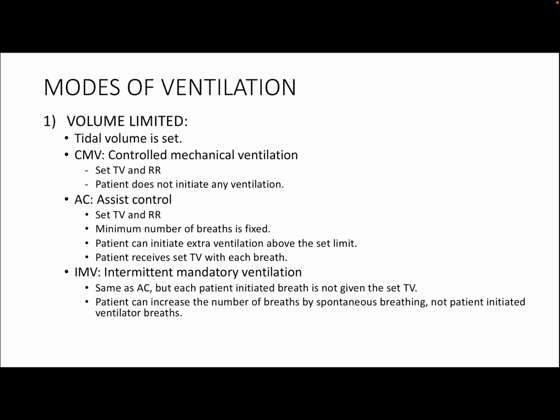Now coming to the modes of ventilation, the first mode that I'll be discussing is volume limited mode of ventilation. In this type, the tidal volume or TV is going to be set. Under volume limited ventilation, you have three types. The first is CMV or controlled mechanical ventilation. Here you will have a set tidal volume and a set number of breaths, that is a set respiratory rate.